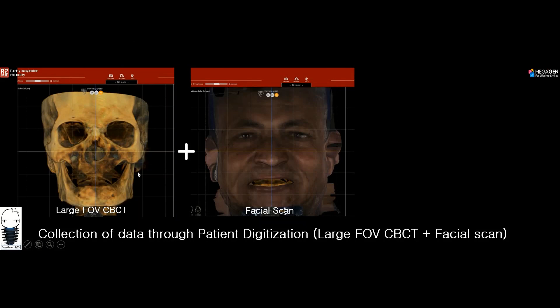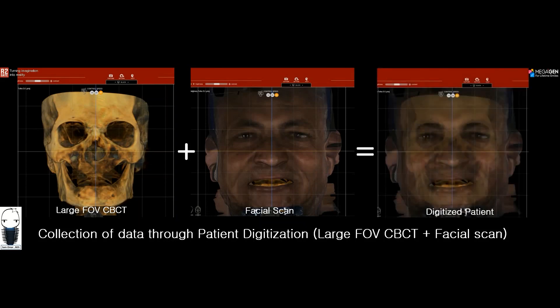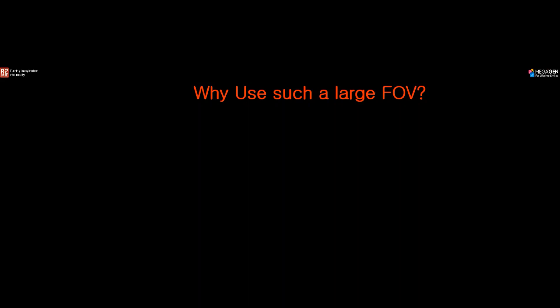We always start with collecting patient data through what we call the patient digitization process. This always starts with a large FOV CBCT — in this case a 20 by 20 FOV — and a facial scan. In our R2Gate digital oral design software we combine this data to get what we call the digitized patient. So why should we use such a large FOV CBCT, and what do we benefit from it?